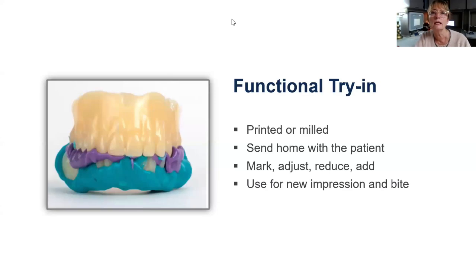Question here. Is there a material you recommend for functional impression that a patient could wear for a few days? Well, this is a printed monoblock through Dentsply Sirona. And I believe it is part of the DLP, Digital Lucitone Print family. But it is the temporary denture monoblock material.